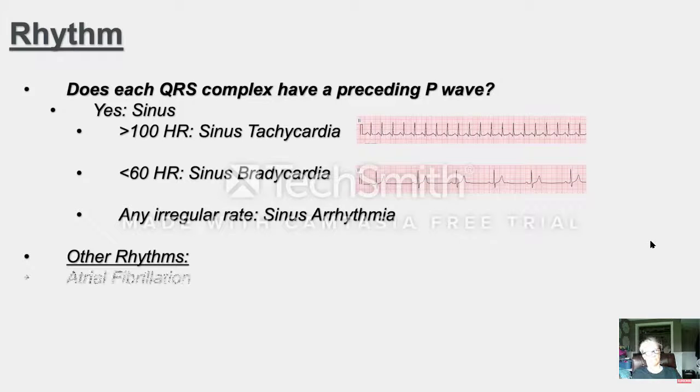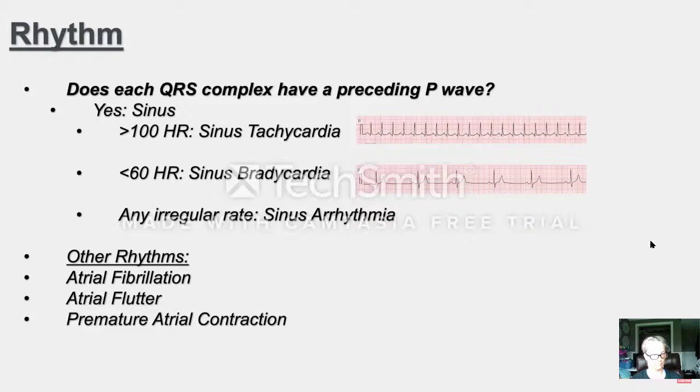The other rhythms we'll talk about in other lessons will include atrial fibrillation, atrial flutter, premature atrial contraction, premature ventricular contraction, and some others as well.